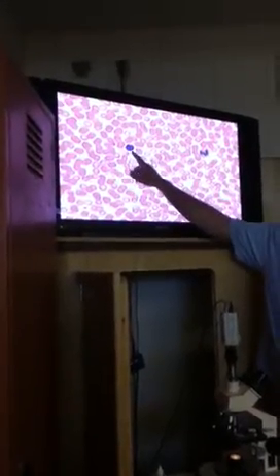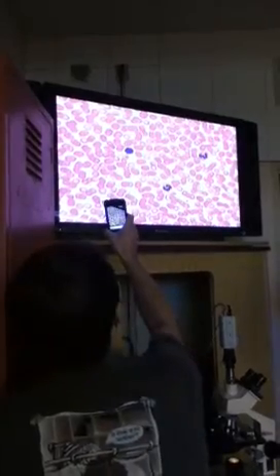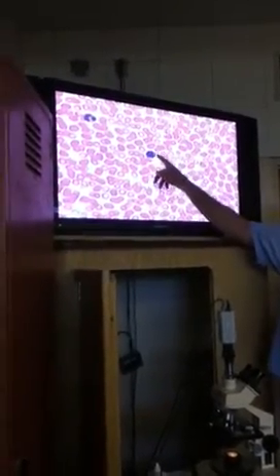Very good. And of course another neutrophil down below. Where's the halo? I can barely see it. So this would be a lymphocyte. There's a halo here and there's one there. Plus it's not granulated. If we ever see a basophil, it looks very similar to that, but they're huge, and they look like they have a bunch of shotgun pellets in it. They're granulated. Here's a classic halo, way out here.